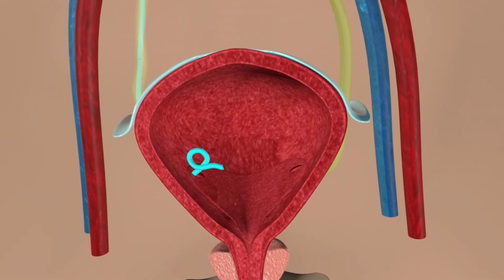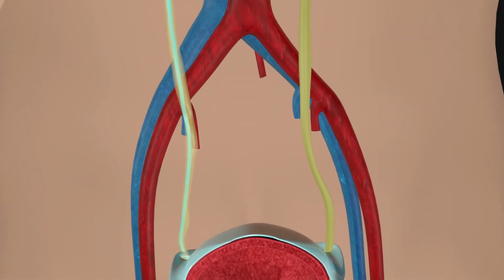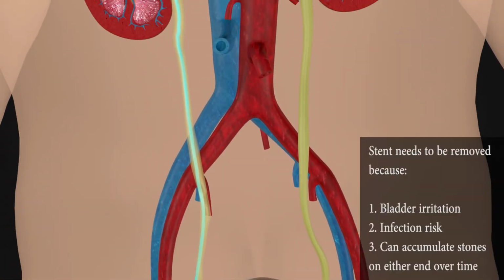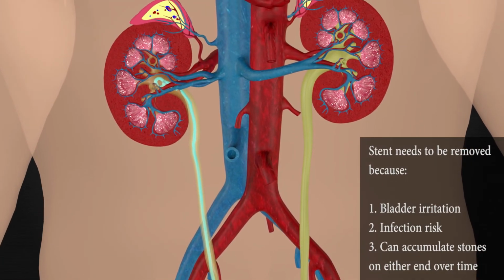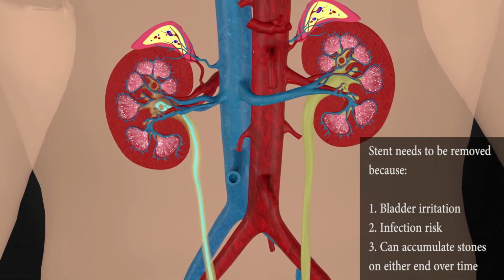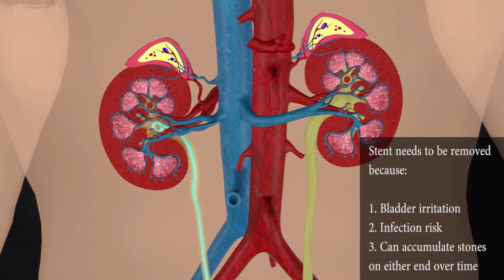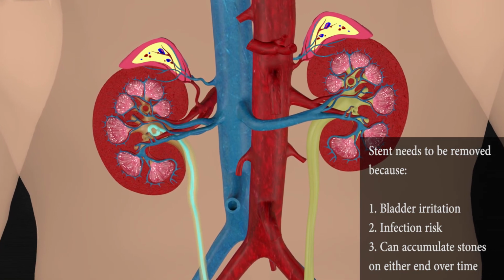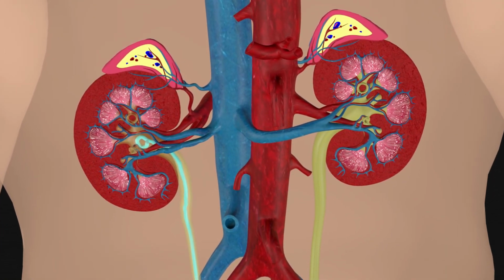A stent is something temporary that we will need to remove in clinic in 1 to 2 weeks. This is also done with a cystoscope. If it is not removed, it will form stone on either end over time, ultimately requiring another surgery in the future. A stent that is not removed can also cause you to have frequent bladder infections and discomfort. Depending on the specifics of your case, you may only need a stent for 3 days, and we may leave it on a string so that you can remove it at home.